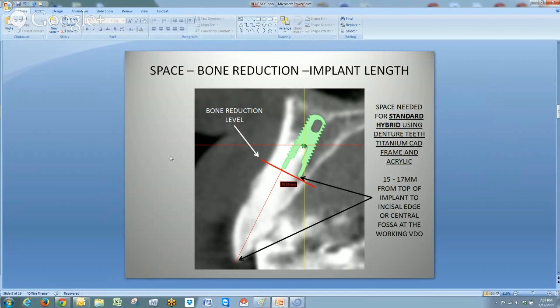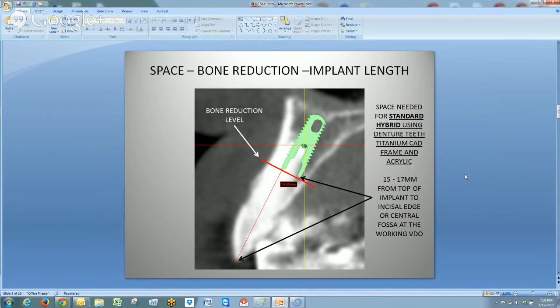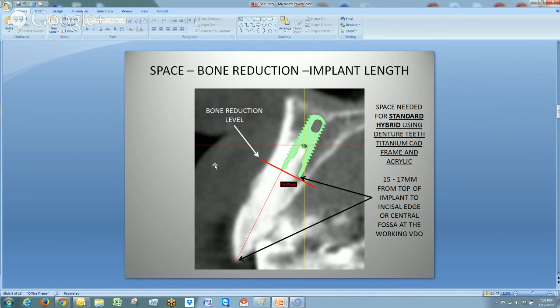The picture here shows that dynamic. What you see is an implant in the number 10 position. The space we need to restore a hybrid is 15 to 17 millimeters from the top of the implant to an incisal edge or a central fossa — 15 being the minimum, 17 being the ideal. In the software, we measure down 17 millimeters, and this becomes the position of the platform of the implant — where the top of the implant should end up when we make a hybrid. So in planning the locator case for a future hybrid, we place the implant in this position, level the bone down, and do the locator case in that manner.